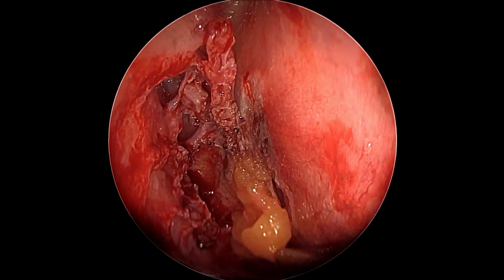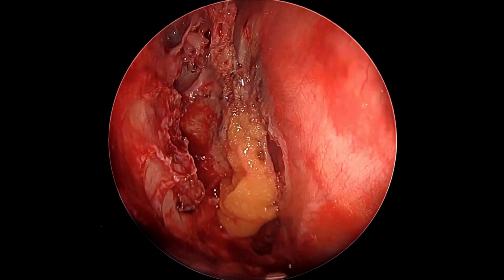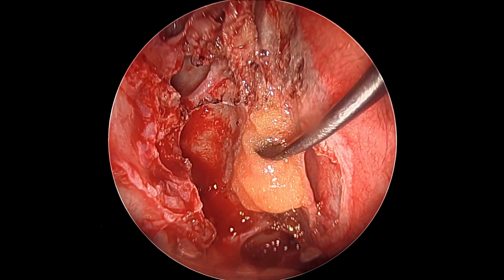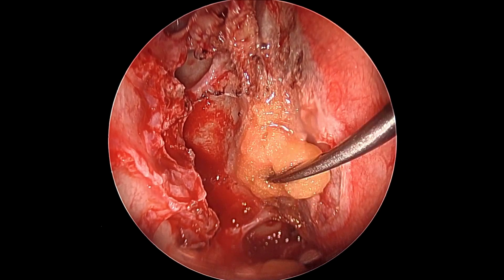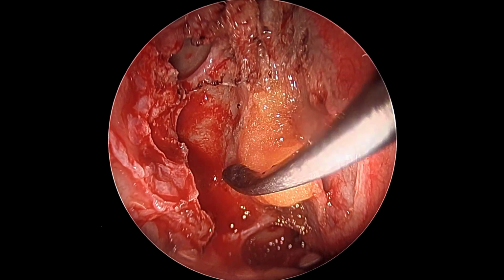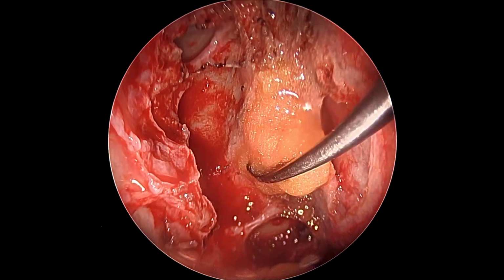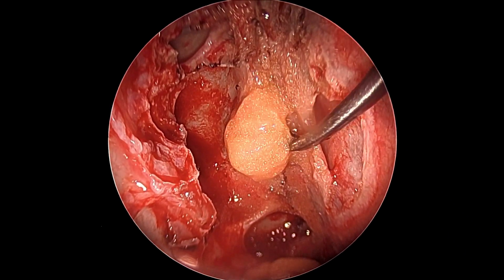We see that it is a little too much, so what we'll do is, while being inside, we'll just cut a sliver of it using the scissors and appropriately size it. Now, post cutting and trimming of the fat, this seems to be very reasonably sized. It is well placed and well tucked inside the defect with the same instrument that we've been working with. It's very good. It doesn't pull the fat back along with it, unlike a ball probe.